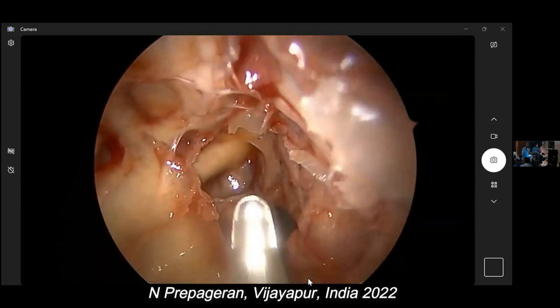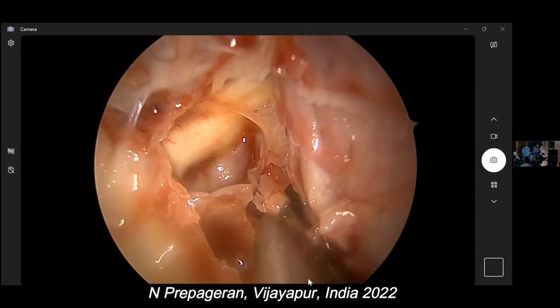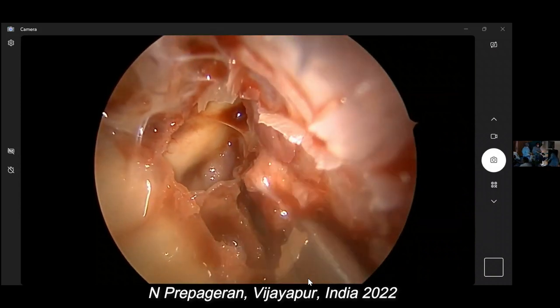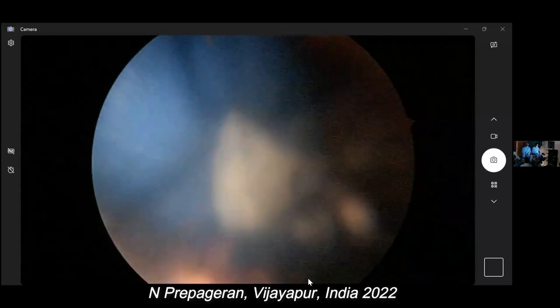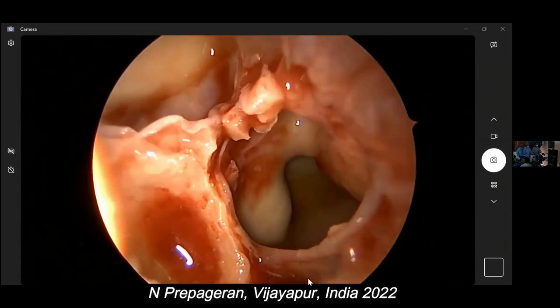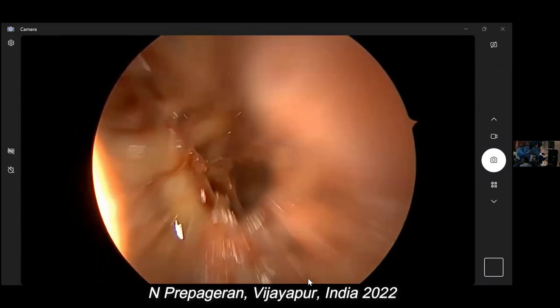Clear? Okay, so now I'm going to remove the anterior wall of the sphenoid sinus so that we can look into the sphenoid sinus itself. So let's look in the sphenoid sinus. Paraclival carotid. Agree? And yes, optic carotid. We can see it. Okay.